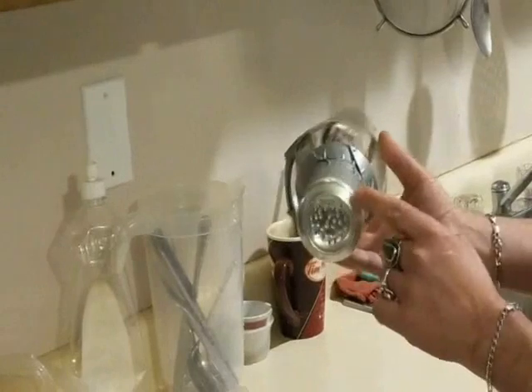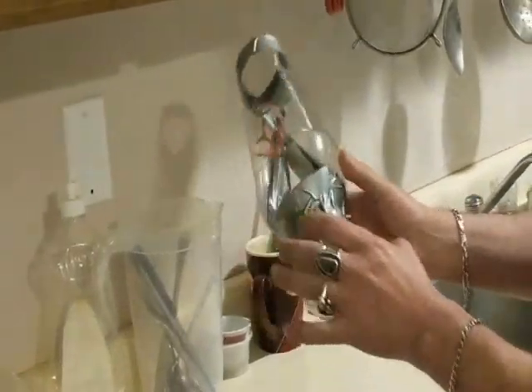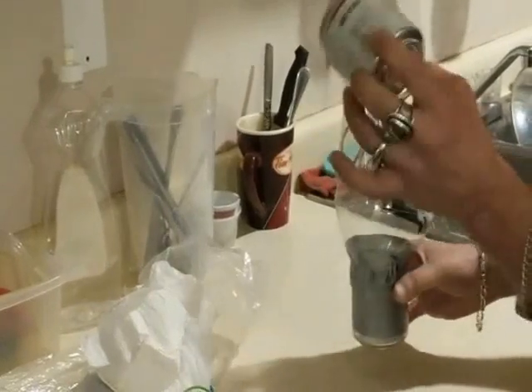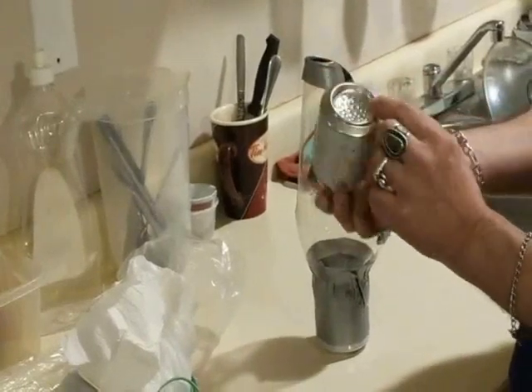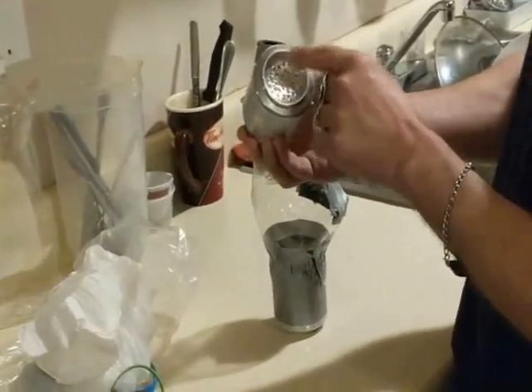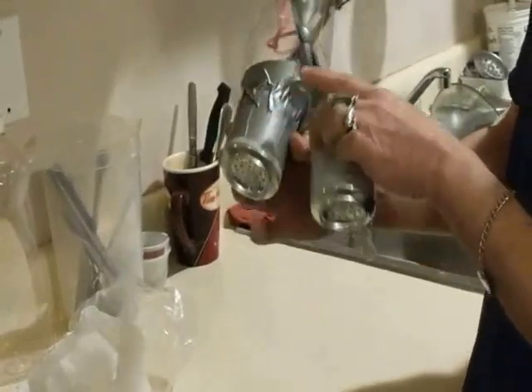This is the filtration. It is a beer can, and it is taped to the mask with duct tape. Now that is a 2-liter pop, a clear one. We are now going to talk about the filtration that connects to the 2-liter pop mask. I punched holes into it with a small nail. You can use a pair of scissors, a knife, or any sharp object. It is exactly the same as what you see on the filtration mask.